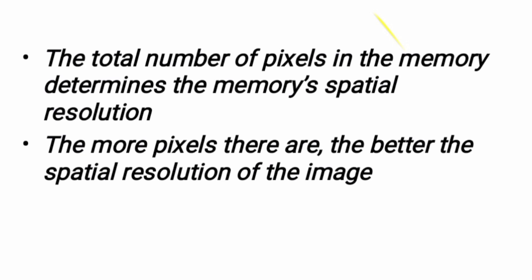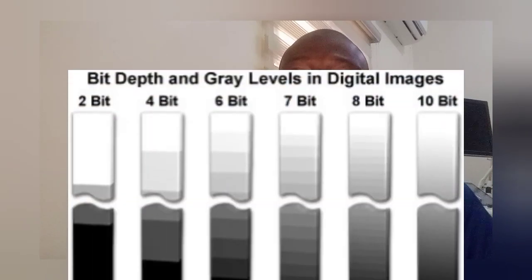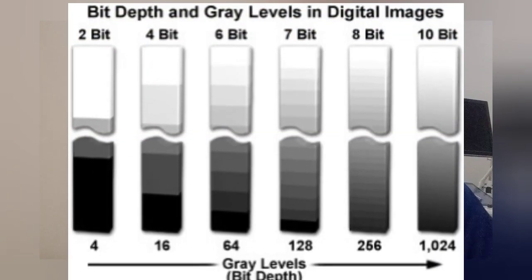Now let's look at bit capacity or bit depth. The number of different shades of gray, the grayscale, that can be used in an image will depend on the bit capacity of the digital scan converter. For example, a 1-bit system, having only one layer, can only store one of two different values at each pixel or address location.